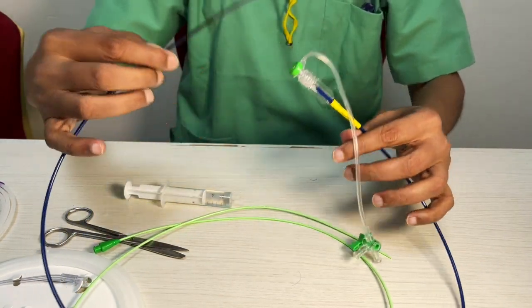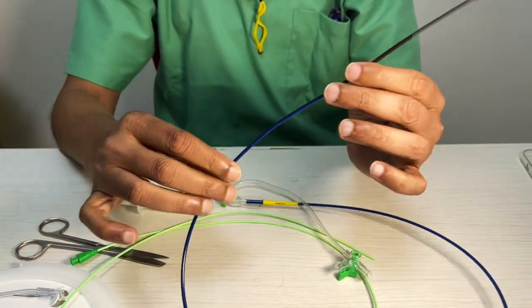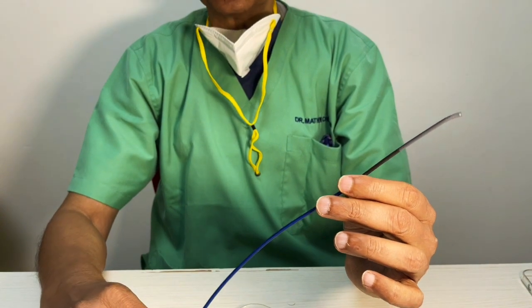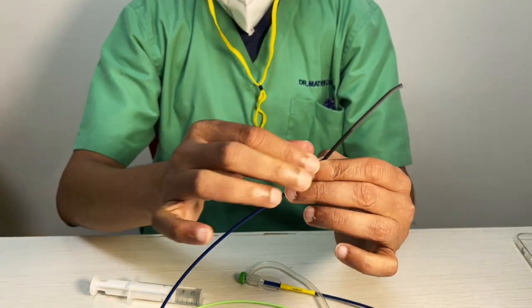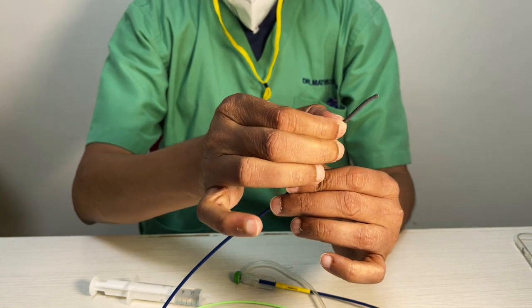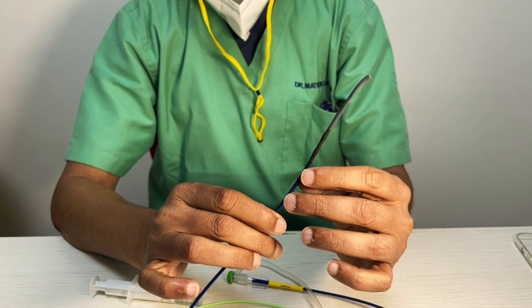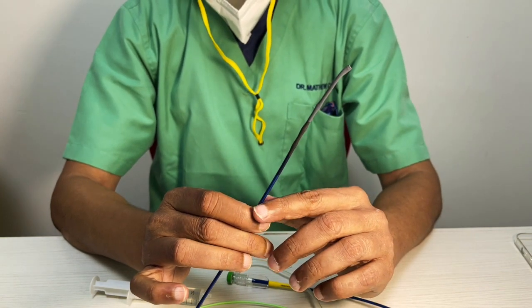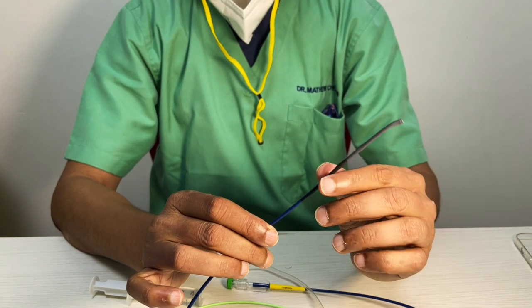Now, the first thing they did, they're going to use the same technology. They'll use steel braiding, but they have given at least 3 zones. This is a real stiff zone. Then you've got an intermediate zone and a much softer zone here. And this is what makes it safe. So technically, you can take a Neuromax safely up to the petrous segment.